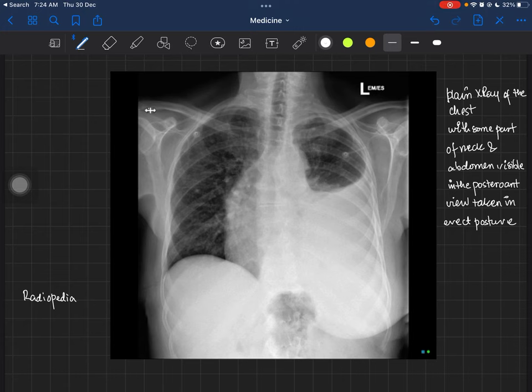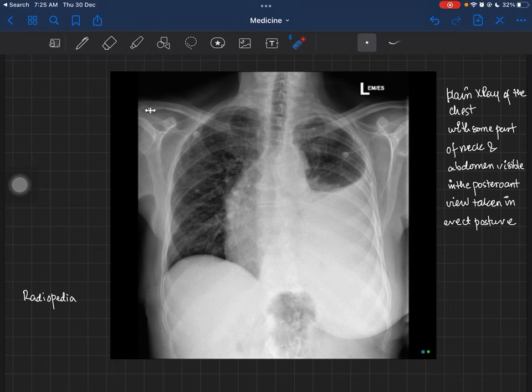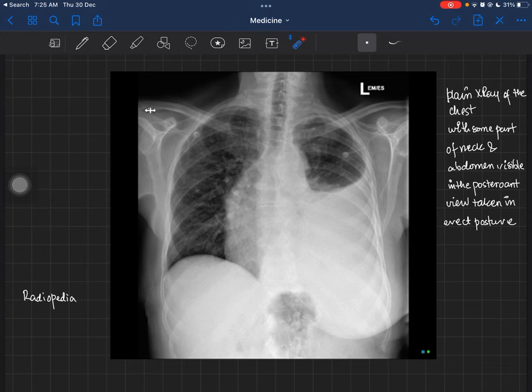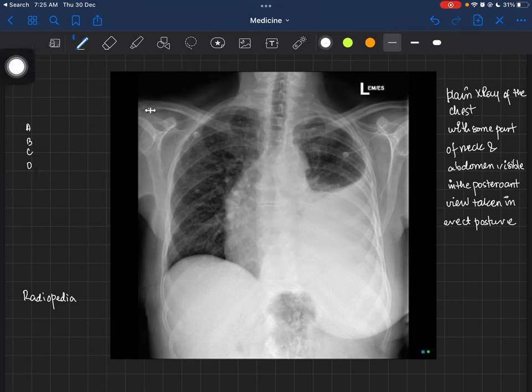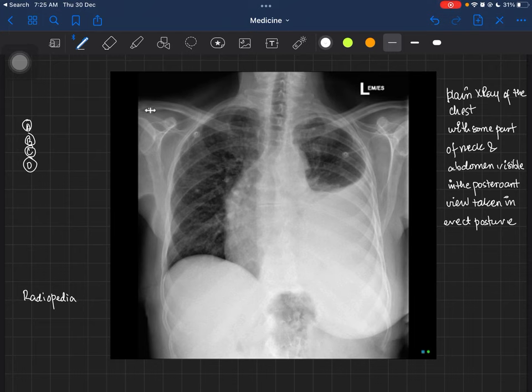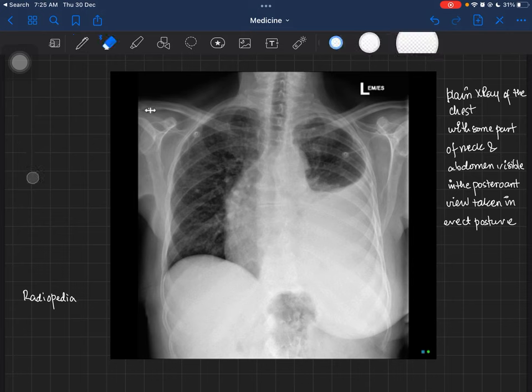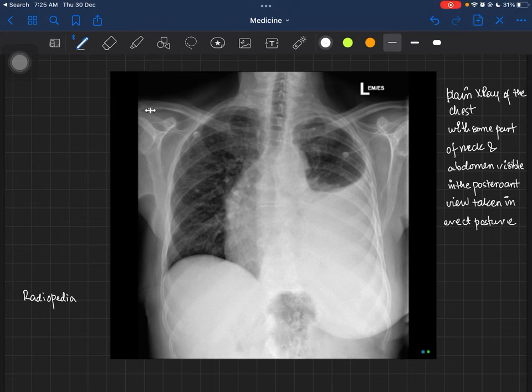Before commenting on the abnormality — which has been visible on screen for a couple of minutes now — you have to comment on the normal findings first. You can start from the middle and go outward, or outside-in. One useful method is the ABCD approach: A for Airways, B for Bones, C for Cardiac silhouette, and D for Diaphragm.